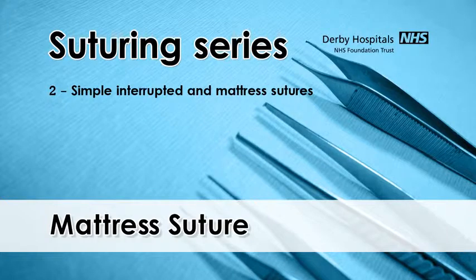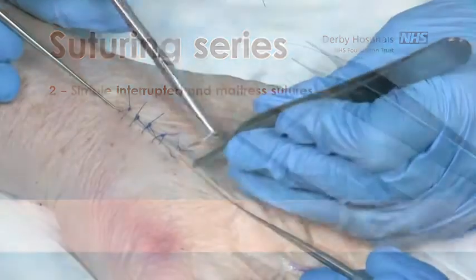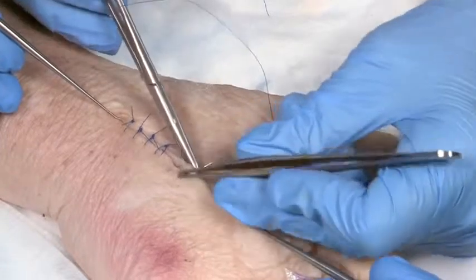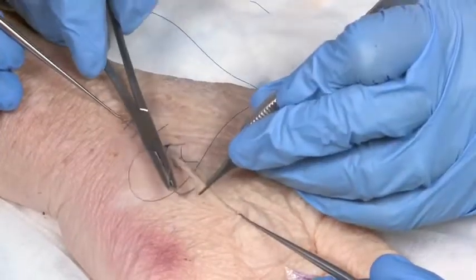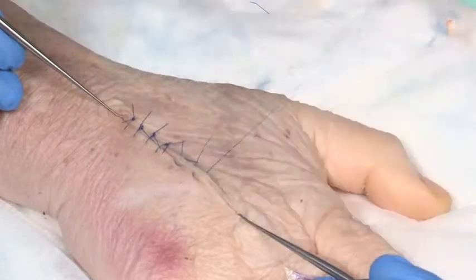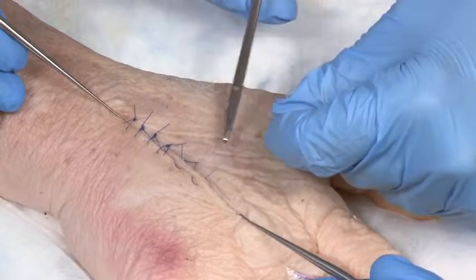Mattress suture. The mattress suture can be used to evert skin edges and approximate irregular skin edges. This is a horizontal mattress suture. Pass the needle through the skin edges as for the interrupted suture, and then reverse the needle in the needle holder and pass it back through the skin in a parallel fashion. Tie the edge of the suture with an instrument tie as for the interrupted suture.